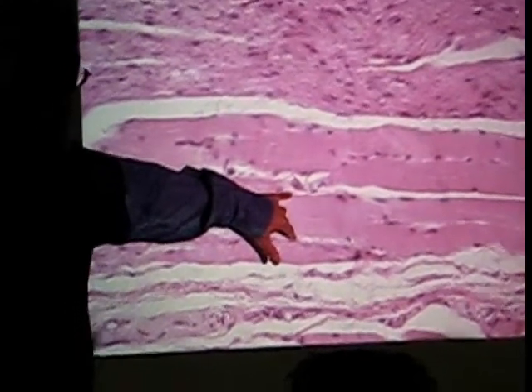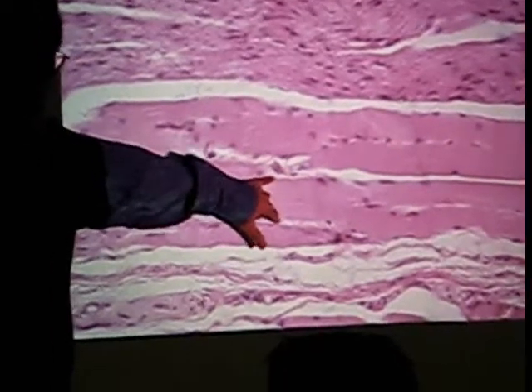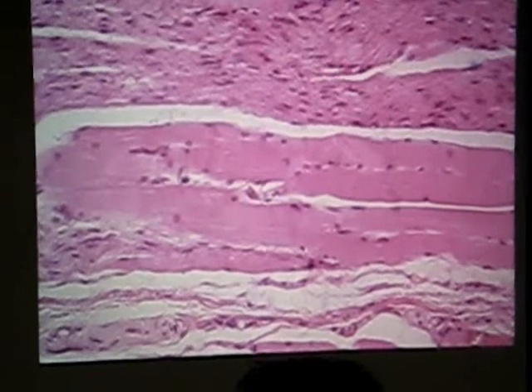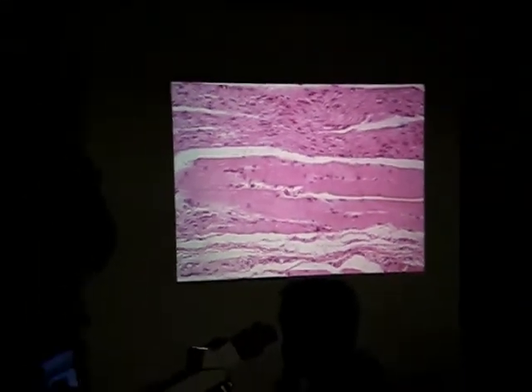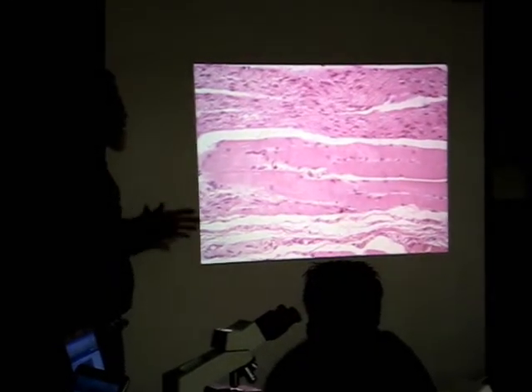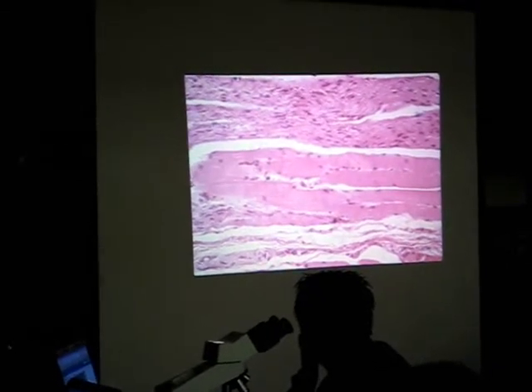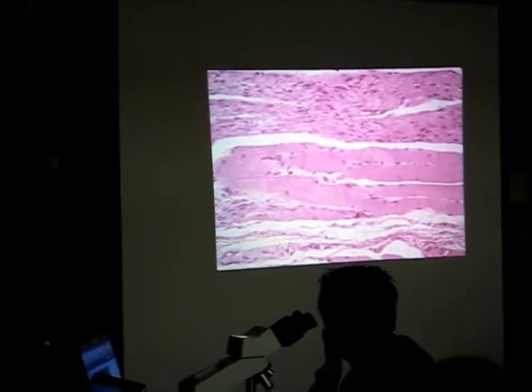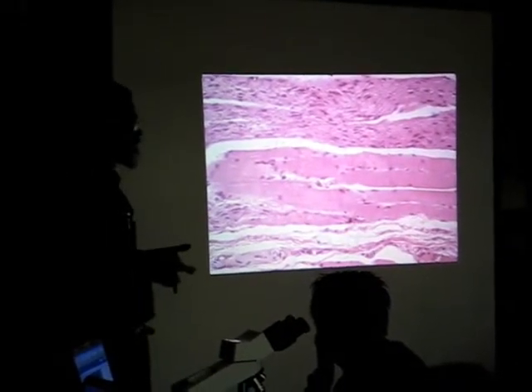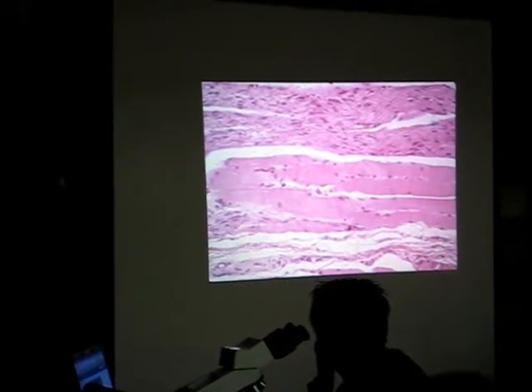And again, I want to remind you that scale is important. That's probably 100 microns right there. An individual smooth muscle fiber or cell is only about 5 microns in diameter. So go back and think about those basics. We did the tissue thing for a reason, so that it'll help you. And the other place where we have smooth and skeletal muscle today was the rectal anal junction. With your knowledge of how to differentiate smooth and skeletal muscle, you can determine what the internal involuntary sphincter is and what the external voluntary is when you're talking about that.